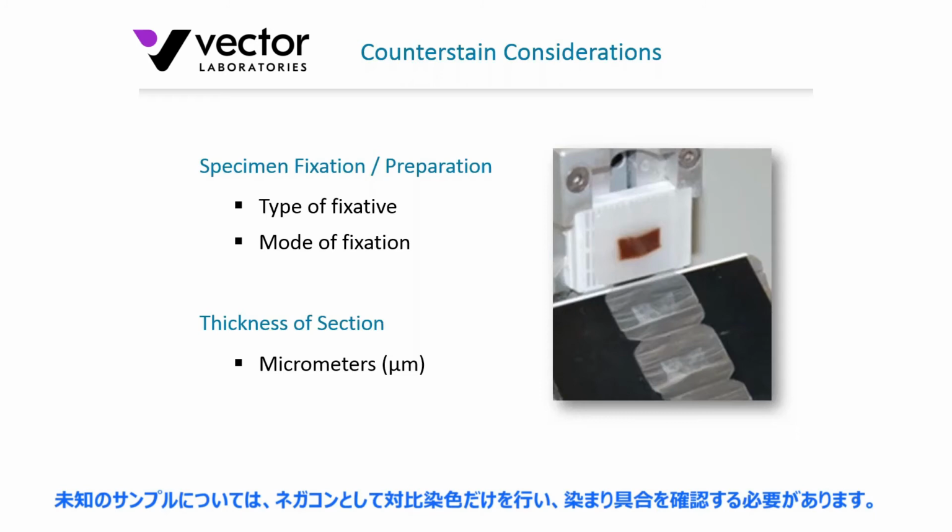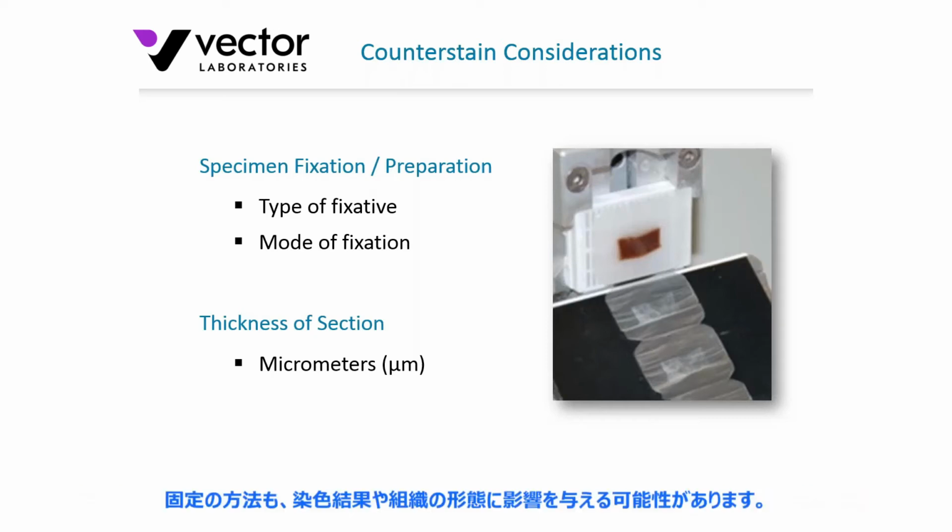It's certainly imperative at that point, working with an unknown, to run that defined negative control of just a counterstain alone, just to get a feel for that intensity of the counterstain. Also, the mode of fixation as well can play into uptake of stain and the appearance of it.